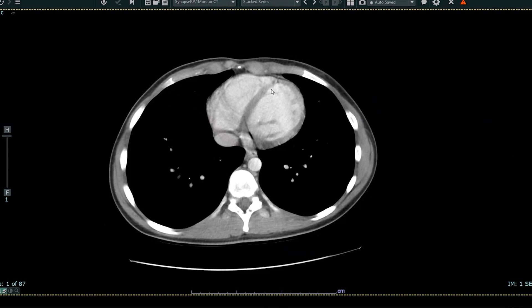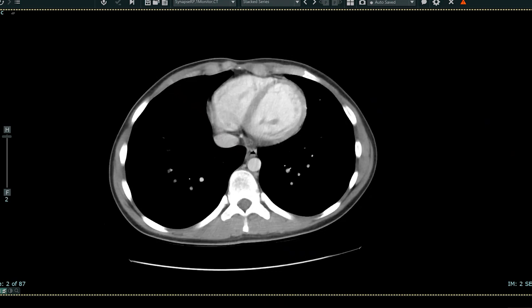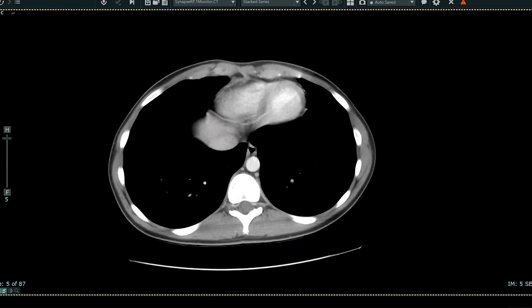To orient you, this is the front of the patient or anterior, and this is the back of the patient or posterior. This is the patient's left side, and this is the patient's right side. These are the lungs — these dark structures here. Here's the heart. Here's the spine. These are ribs out here, these white structures. Now I'm going to scan more inferiorly.